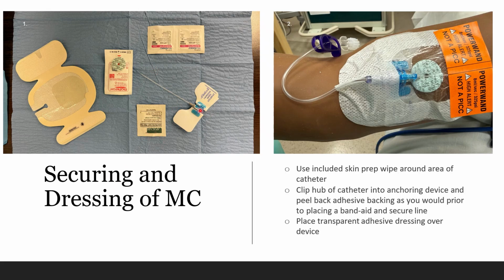So this is our non-trimmable catheter. It's got this specialized stat lock, as they call it. It's where this blue clip has some blue arrows. So when you go to attach it to the hub, it should be oriented where the arrows are in the same direction that you intend for any flow to go through it. They've got these little backings, so this is almost like a band-aid. Got some alcohol prep pads, skin protectant, and it almost acts kind of like primer.